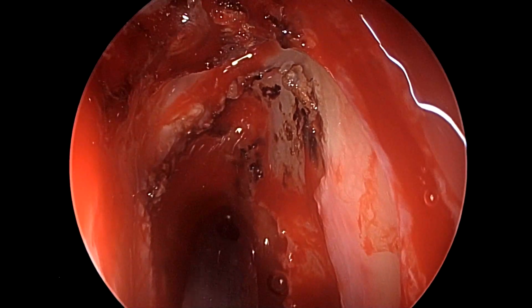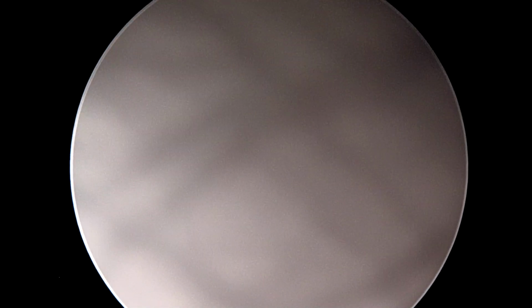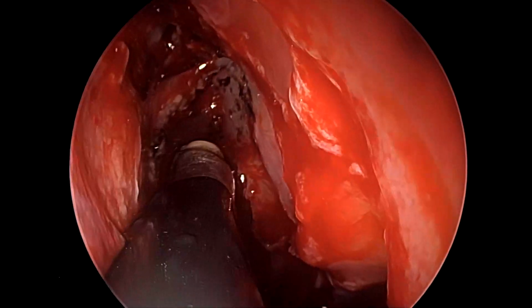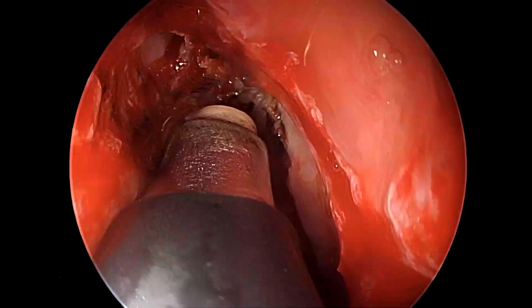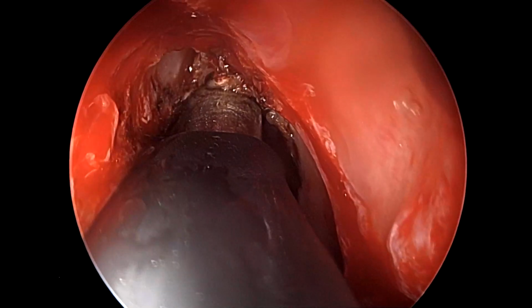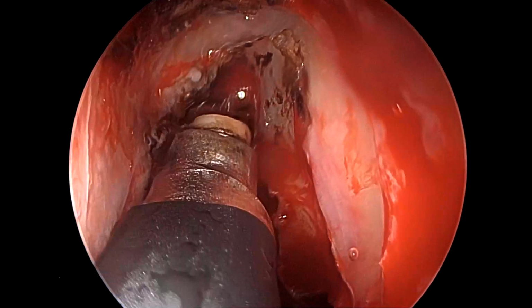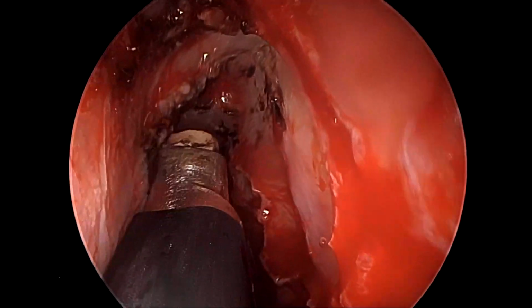the entire preparation for grafting must be made clearly, and hemostasis has to be achieved and made sure of. There's no bleeding, no oozing, no pieces of thin fractured bare bone, no excess mucosa to lead to mucocele formation. So it's imperative to be sure that we have nicely and completely ablated all the mucosa around the skull base defect, and much more in excess of it, because we anticipate two layers of graft here. One would be an inlay and the other would be an onlay or overlay to cover the first graft. So much more bone would have to be made bare as compared to simply the size of the defect.